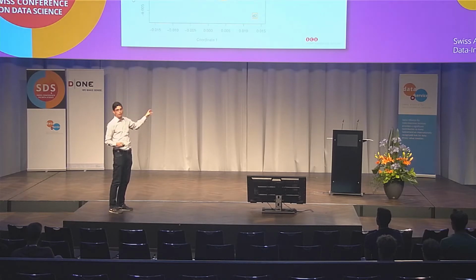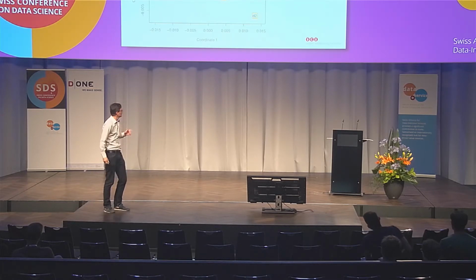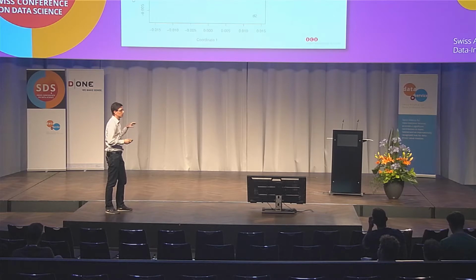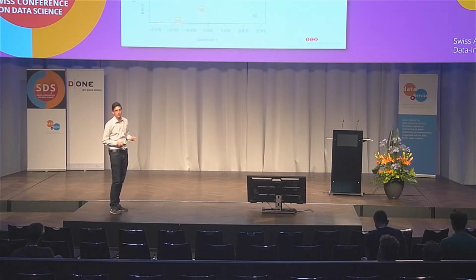And you can see the variability is quite large. Doctor 3 generated labels similar to our labels, but Doctor 2 and Doctor 1 generated quite different labels. Additionally, we asked so-called reading center experts, indicated by the C here, to label the test set again. Reading center experts are people who on a daily basis grade or see such OCT images, so they are real experts in understanding OCT images. You can see their labels here on the plot by C1, C3, and C2, and again we see variability.